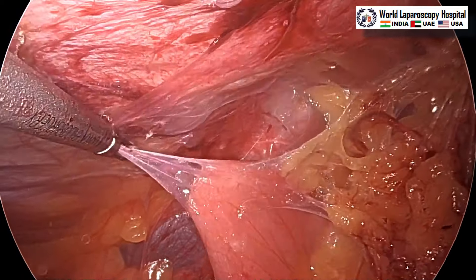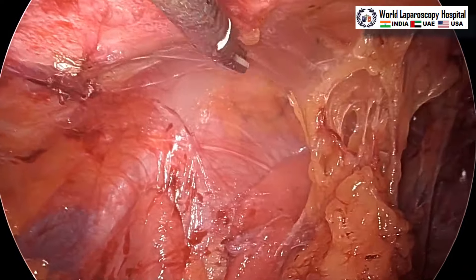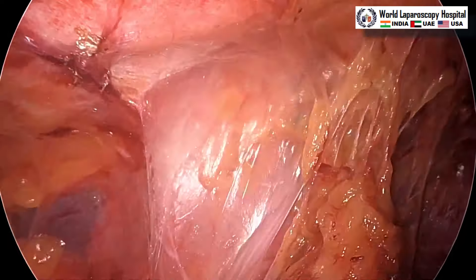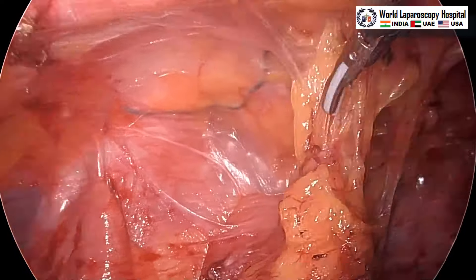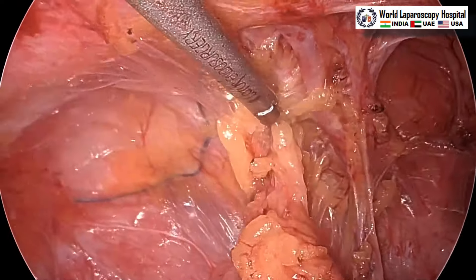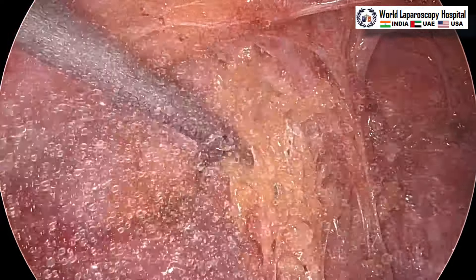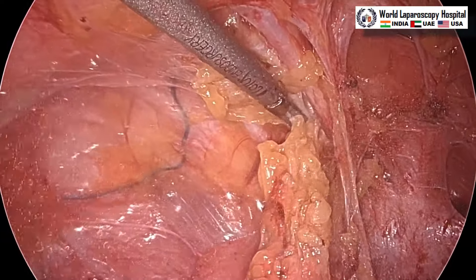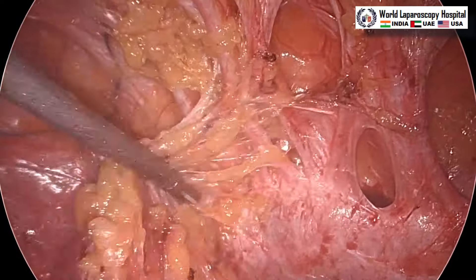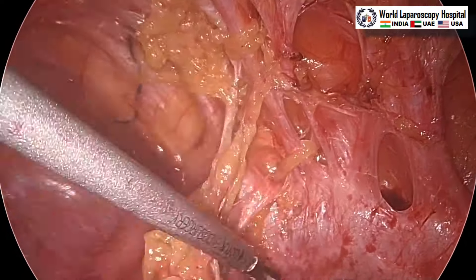This is also a small bowel adhered, but thankfully the serosa is not directly adhered. Sometimes if the serosa is directly adhered to the anterior abdominal wall, you should use cold scissors to separate it. But these adhesions have a flimsy contact with the anterior abdominal wall, so harmonic will do a better job and blunt dissection can also work. We can see multiple other bridges also visible — these bridges we will not destroy or cut because they will give support for our hernia surgery. In IPOM hernia surgery, these bridges will give the support.